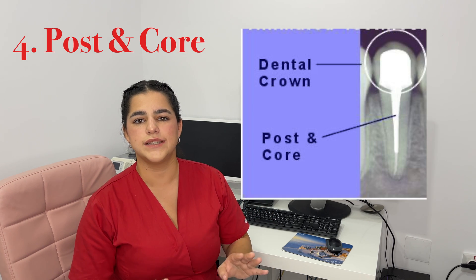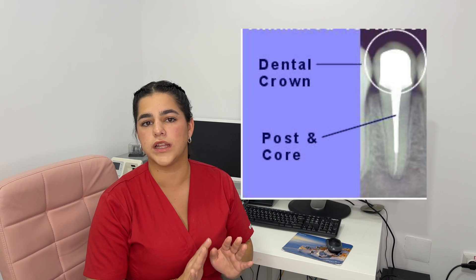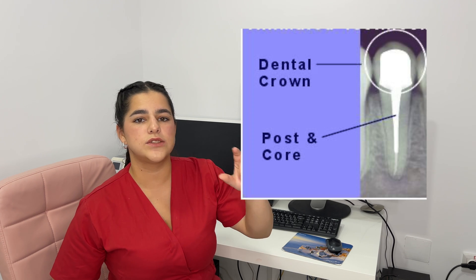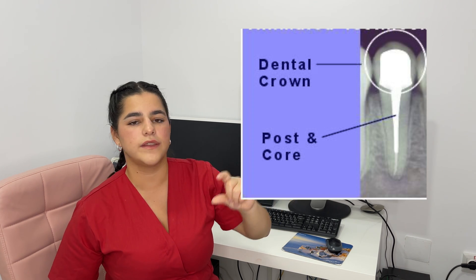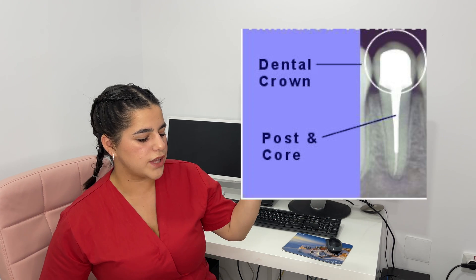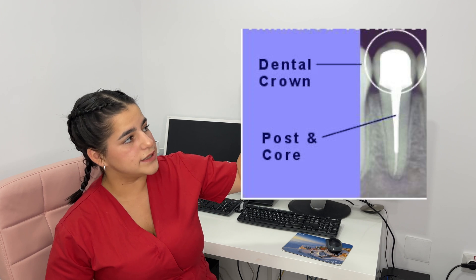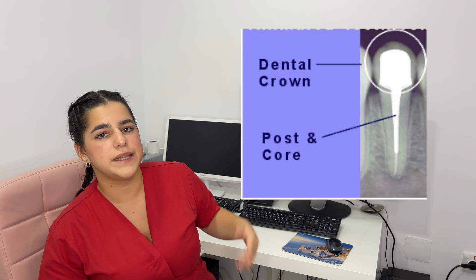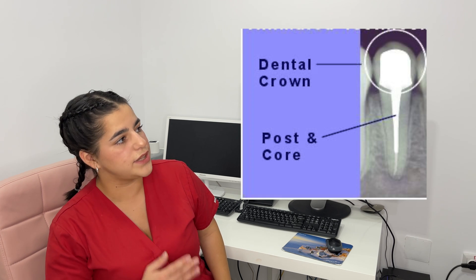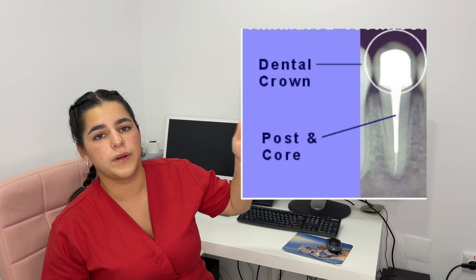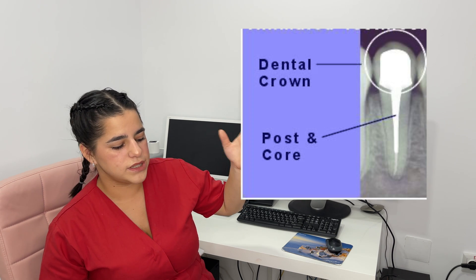When talking about post and core, before placing one we must ensure there is a proper endodontic treatment on the tooth. We always have to leave at least one third of the gutta-percha, and the two thirds are filled with the post and core. As you can see in this image, we have the dental crown and the post and core, with that little piece at the bottom being the gutta-percha left inside. This one is placed correctly — the tooth is intact and everything is fine.